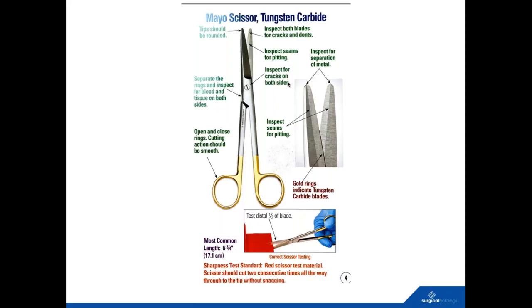It's something that absolutely should be happening every time. And I've heard that same reasoning here in the United States, where people say, well, why should we test it? Because the surgeon's going to do that. And I think it's really important to look down at the bottom of this slide where you see that testing material that they're cutting through. If we don't test to make sure the instruments are sharp in sterile processing in the CSSD, then the test subject is the patient.